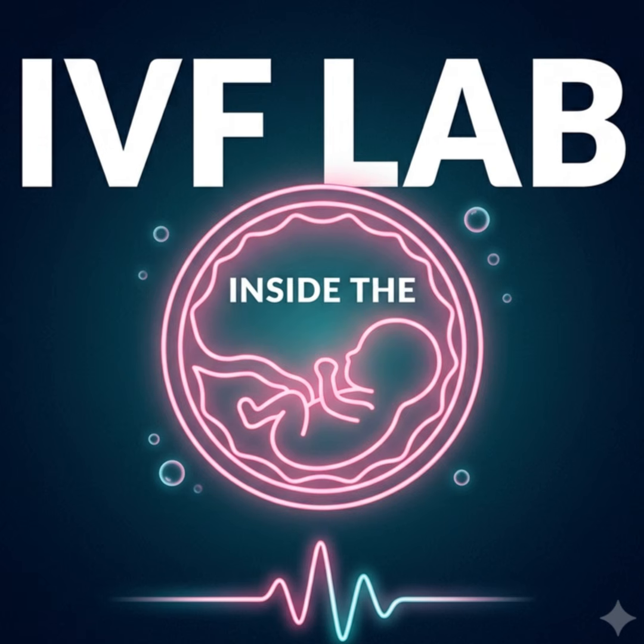So they're just like empty bubbles. Pretty much. They're essentially cellular debris trapped inside the shell of the embryo. Now, a small amount of fragmentation is entirely normal and often completely harmless. But if an embryo is highly fragmented, it means it's actively losing critical cellular mass and energy. Wow. Okay, so cell number, symmetry, and fragmentation.